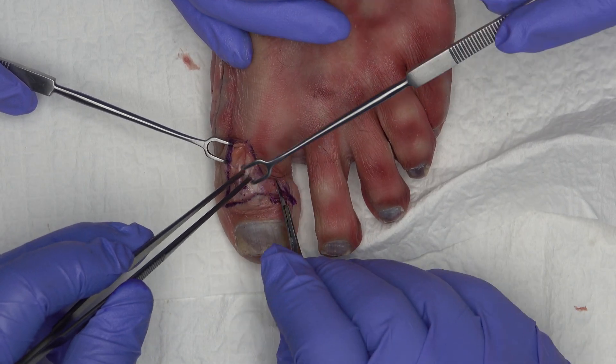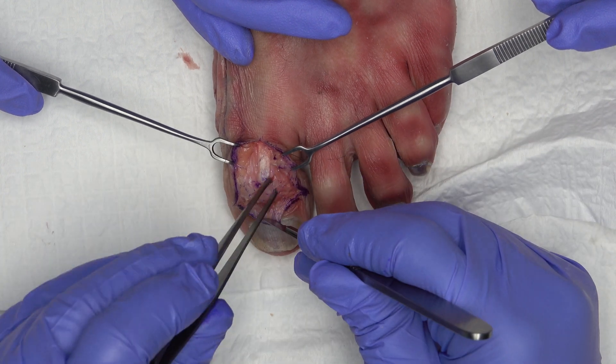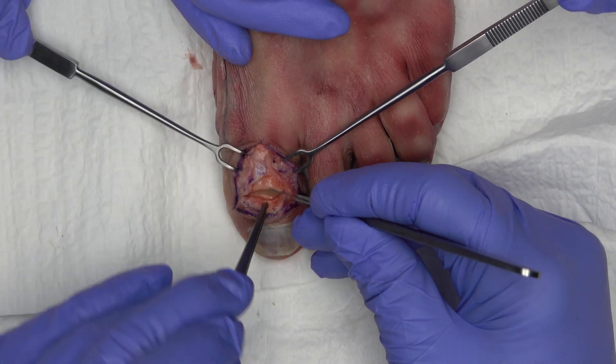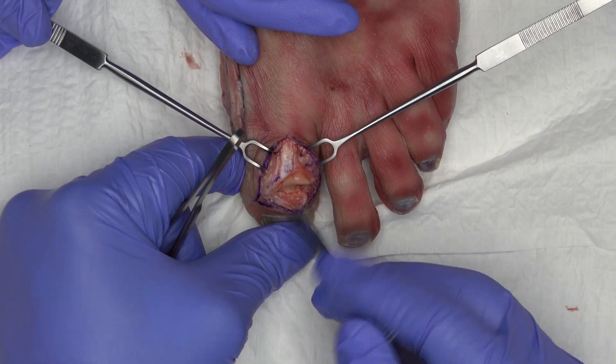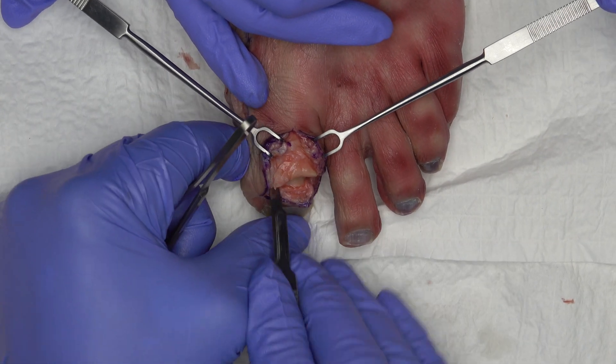The extensor tendon is cut close to the attachment at the distal phalanx. However, the distal tendon stump should be chosen long enough to allow end-to-end suturing of the tendon. The two collateral ligaments are then cut.